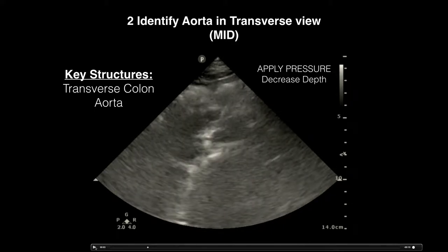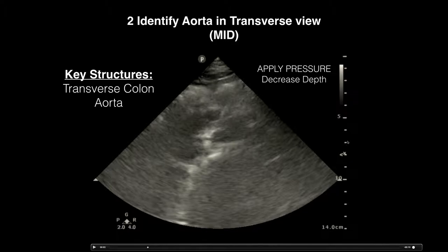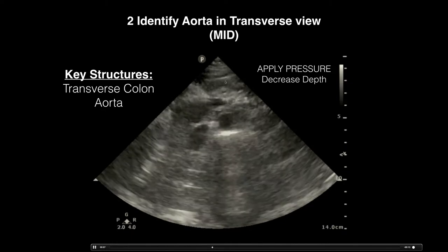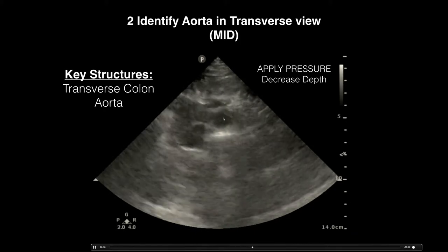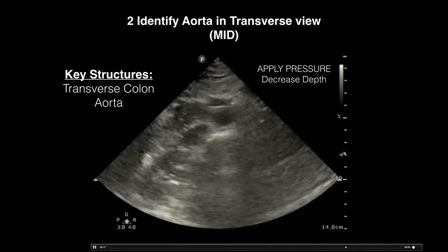As you go more distal, you reach the mid aorta — probably the hardest portion to view since there's so much transverse colon anterior to the descending aorta. Apply pressure and decrease your depth a little bit, because as you scan more distally the aorta becomes more superficial — around six to seven centimeters at the mid level. There may be a lot of bowel gas, but applying pressure will bring out the abdominal aorta for visualization.